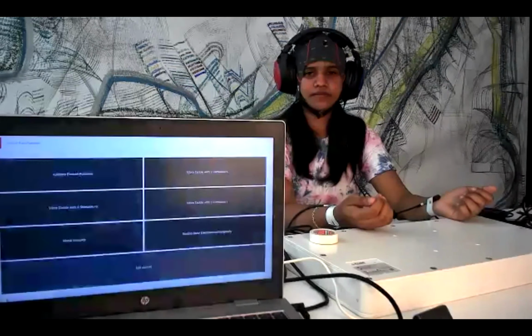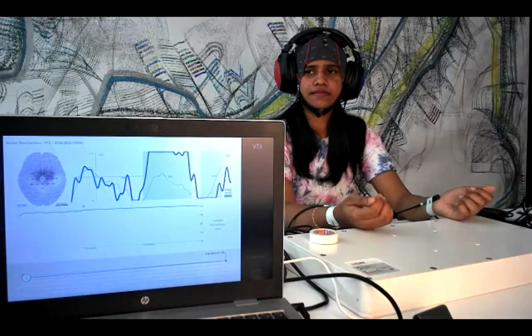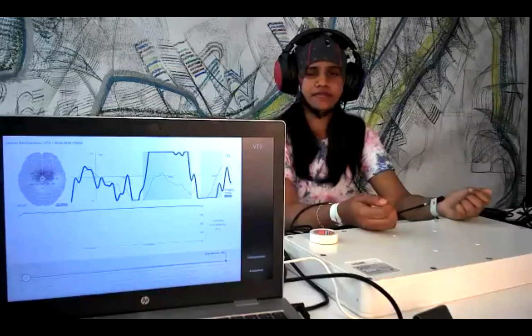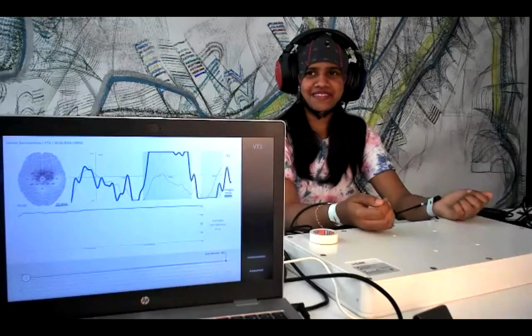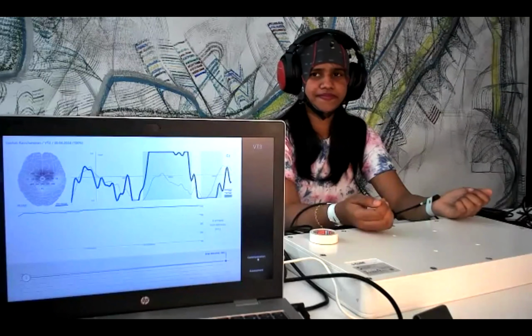So I think I still have a few minutes. I will try maybe 1 or 2 communications, given the very high accuracy in the VT3. So I believe we can achieve a good accuracy also in the communication. So we'll go to the communication.